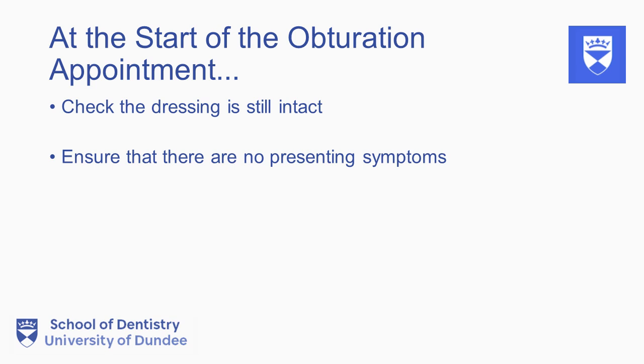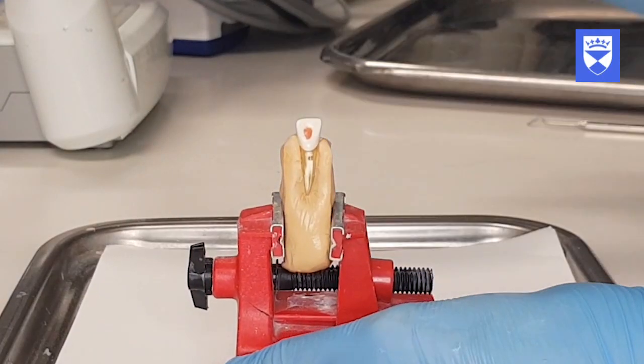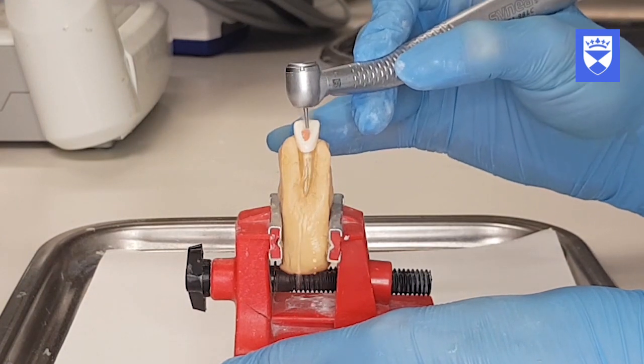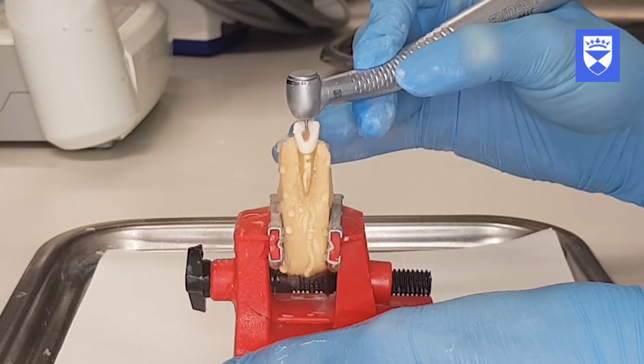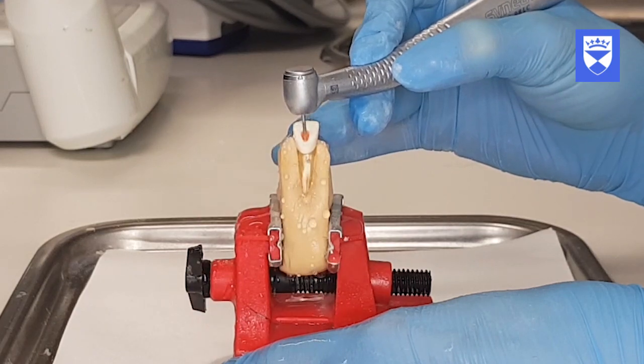Before removing the restoration, remember to give local anaesthetic in case of residual inflammation. Place a fresh rubber dam and begin removing the dressing. To remove the temporary restoration, drill into the restoration using a high-speed diamond fissure bur until the coltazole lining can be seen. Remove the whole temporary restoration and the lining and take out the cotton wool pledget covering the canal orifice.